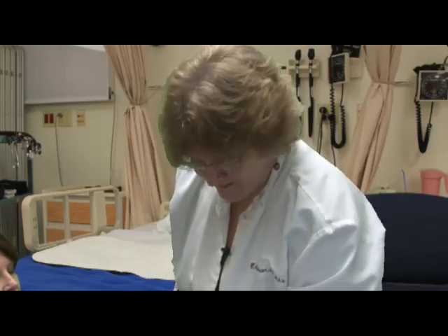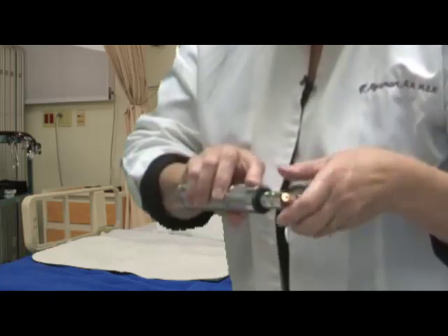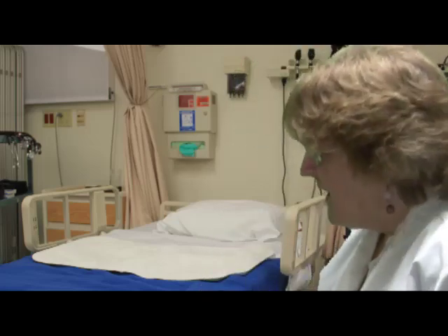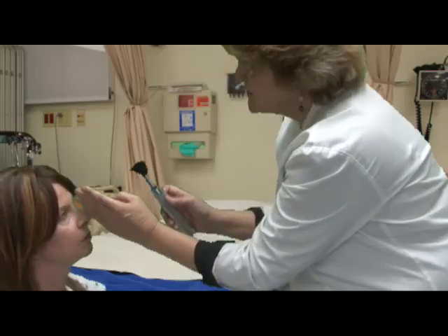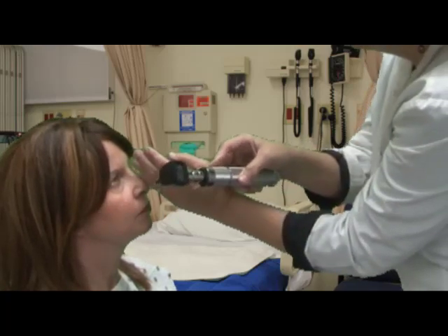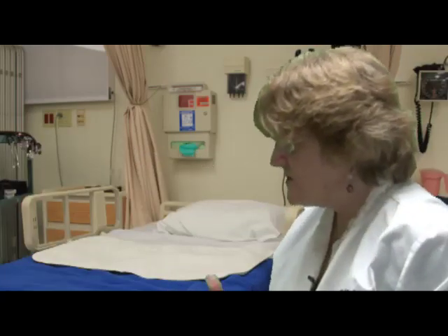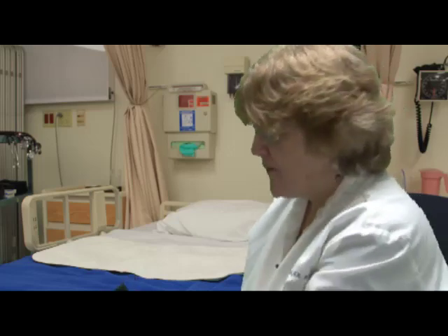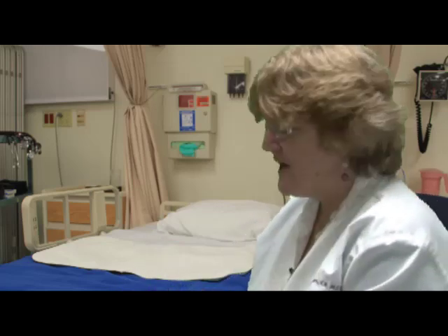For the pupil test, I'm switching to the otoscope light. I'm checking that her pupils are equal, round, and reactive to light. I place my hand by the nose, bring the light from the side, shine it into one pupil and watch for constriction, then repeat on the other side. Her pupils are equal in size and round, and they were reactive to light — both directly where I shone the light and consensually on the other side.